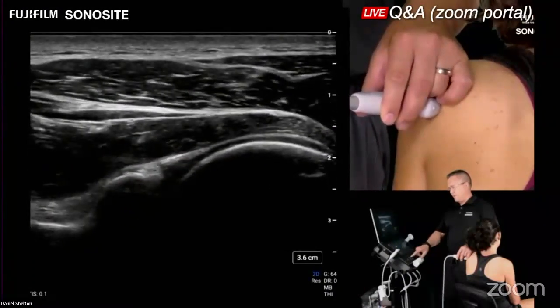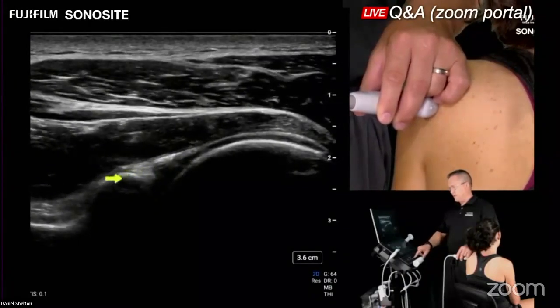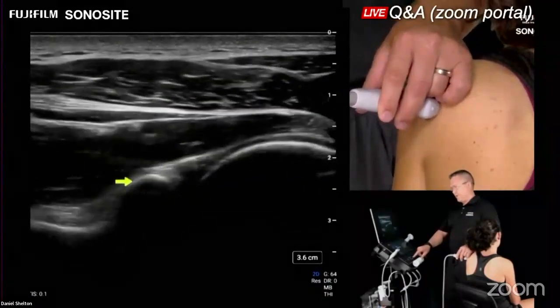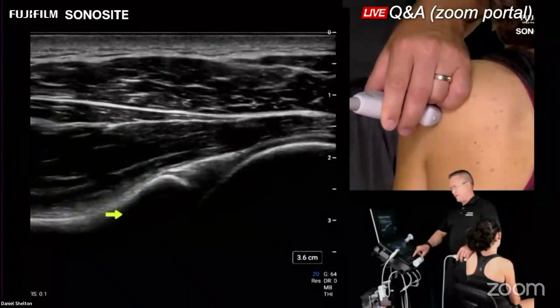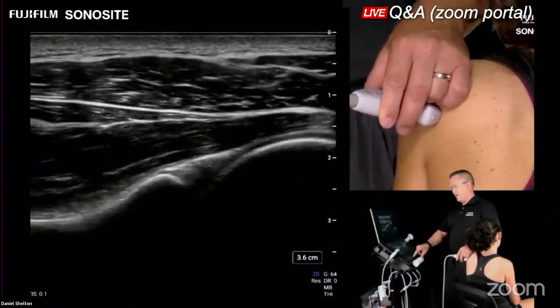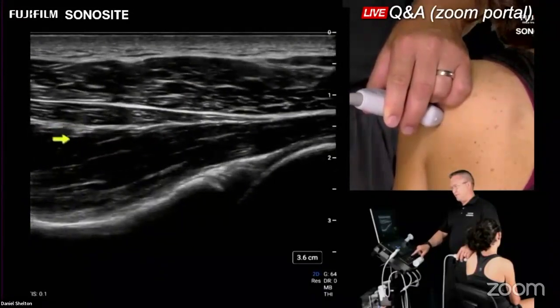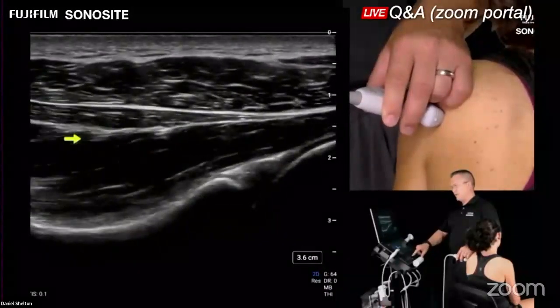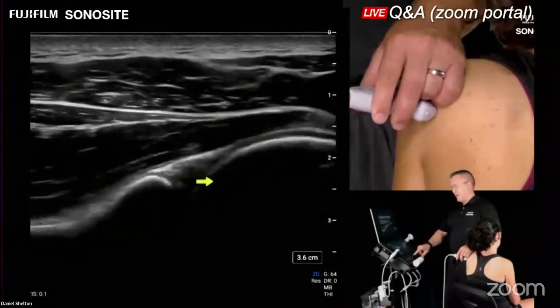And then point out the next cortical landmark that we rely on, which will be the posterior glenoid tubercle here. So this is the posterior glenoid tubercle. And then back here, if we keep following the slope, is the infraspinatus fossa of the scapula. And then above this is infraspinatus muscle and central tendon, one of the pinnate directions of the central tendon. We'll get to the rest of the tendon momentarily.